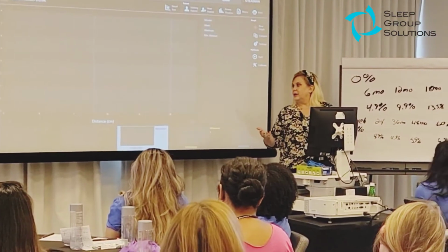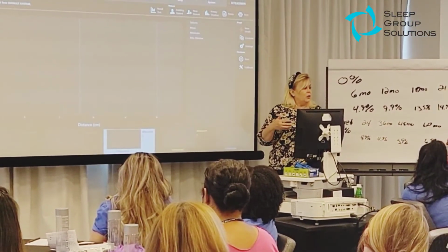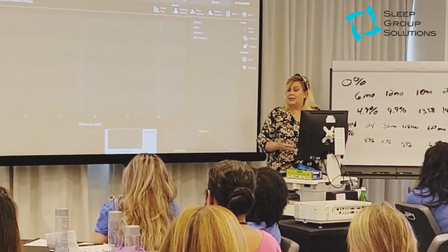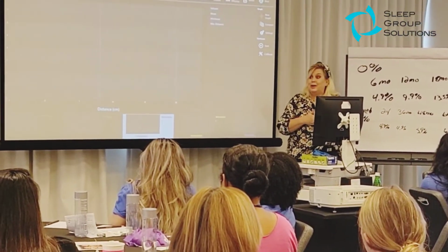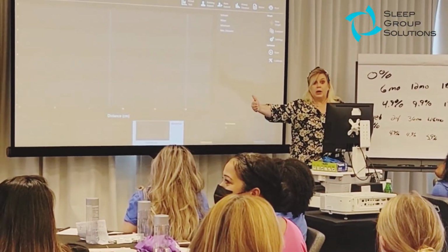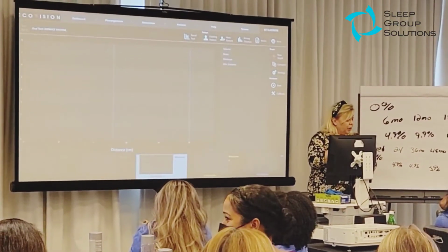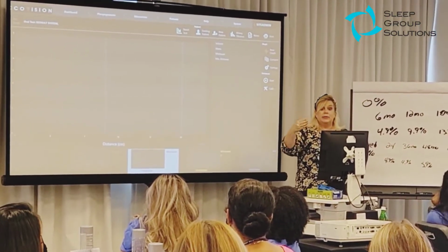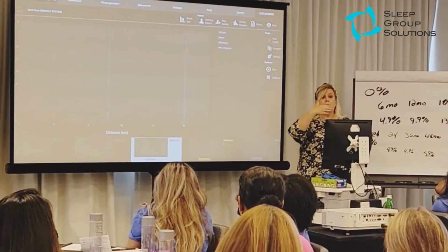How do I make it? What size do they need? How do you make them? Where are you going? Well, until we had this technology, we basically just guessed a spot and prayed we didn't kill them till we got them to a spot that actually worked. We would start at an average spot and then slowly advance them with repeated sleep studies until we got them to the spot that we thought that they were good, which means we treated them like they were a trombone.